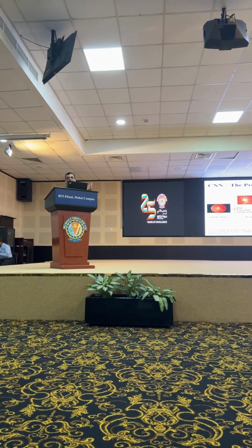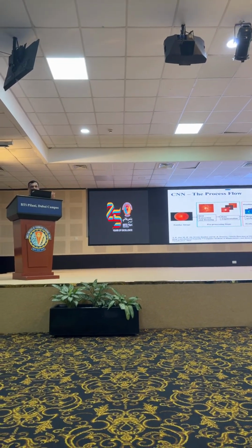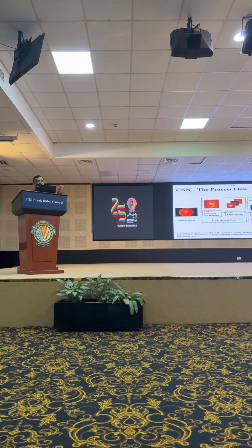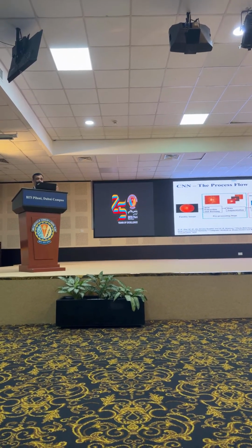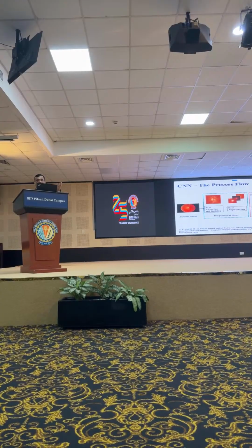So we use XAI techniques to visualize and try to get confirmation from the doctor that yes, indeed. If it is not, then you need to conclude that it is giving high accuracy, but the accuracy is not based on the features that typically characterize glaucoma, but on something else. All these cases you will see in my presentation.